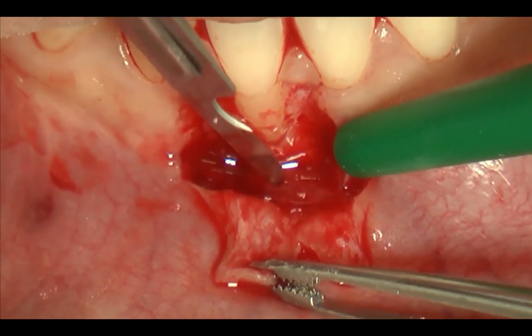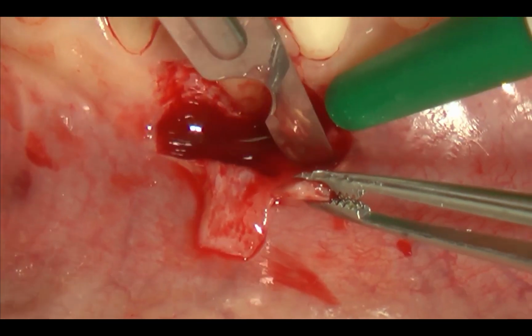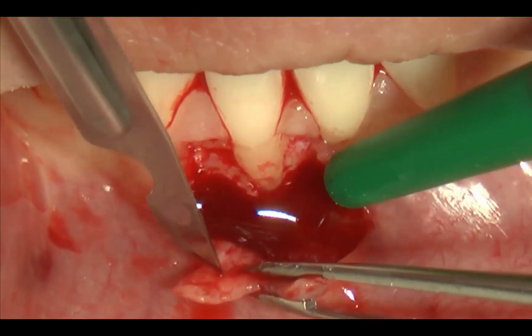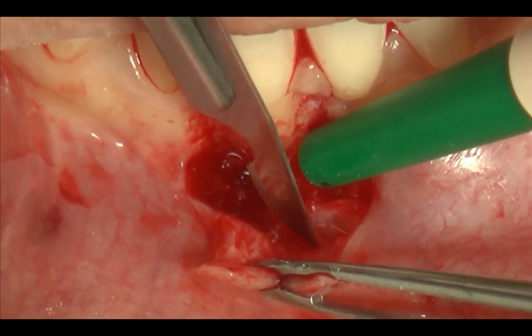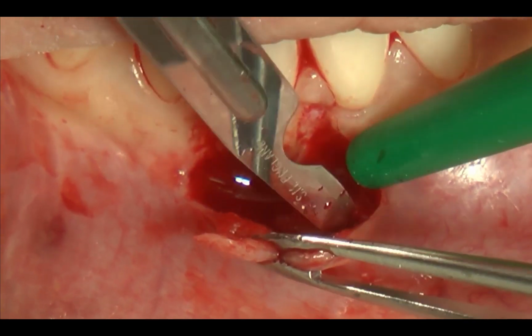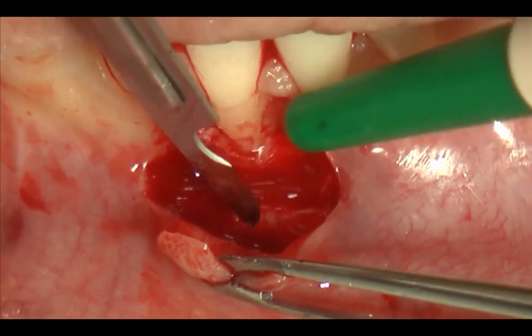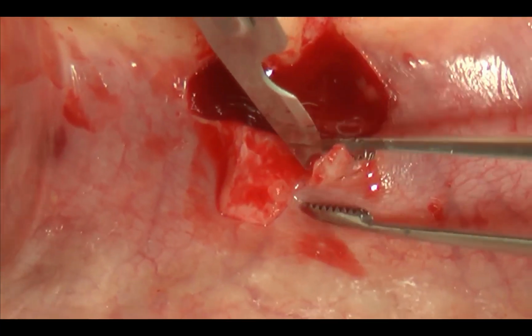With this superficial incision, you are removing muscle from the inner aspect of the alveolar mucosa, so that you see that the muscles start to be isolated.